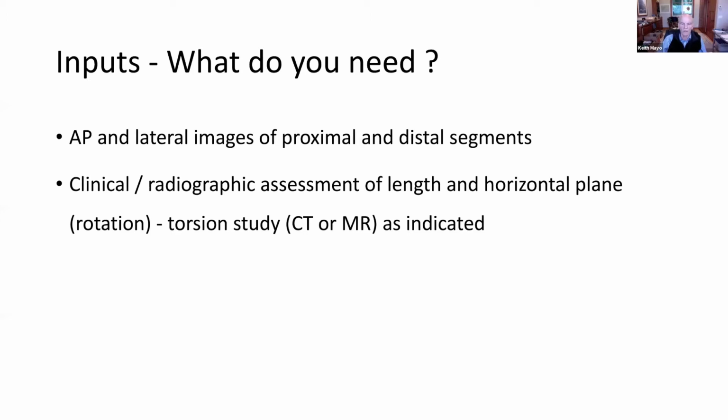We spent a lot of time harping on how to get perfect x-rays. Well, for this exercise, the classic preoperative normal planning x-ray would be a torsion compensated perfect AP of the proximal femur, which would mean that you'd know in advance what the torsion was.